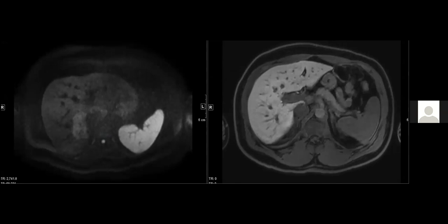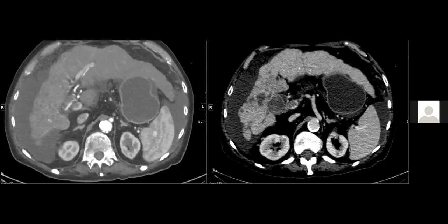Nellie, do you remember one of our first case conferences? I presented an epithelioid AML, and Matt Davenport was on, and we talked about this. For the kidney? Yeah. In my case, what I learned was, it was a patient with tuberous sclerosis, multiple other AMLs, but my lesion was a large enhancing lesion invading into the IVC. And so we didn't know if it was an RCC invading the IVC, and then it turned out to be an epithelioid AML. So they're much more common in patients with tuberous sclerosis, and they can mimic, especially in the kidney, an RCC.